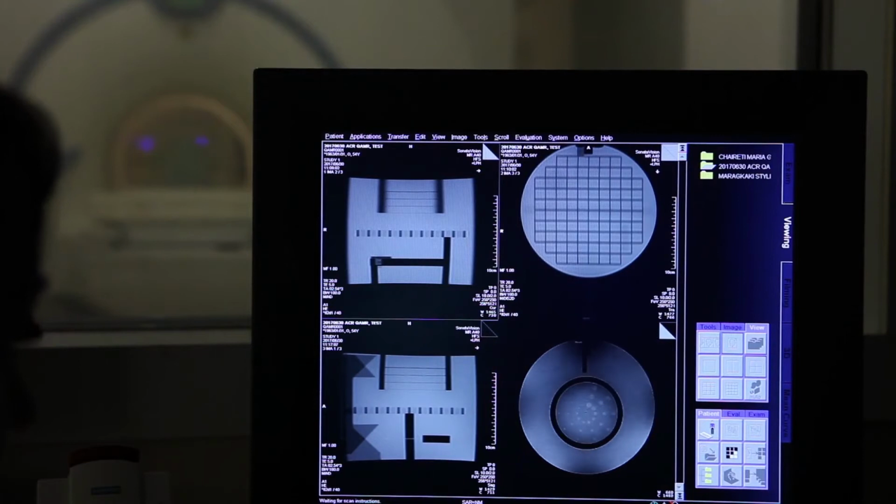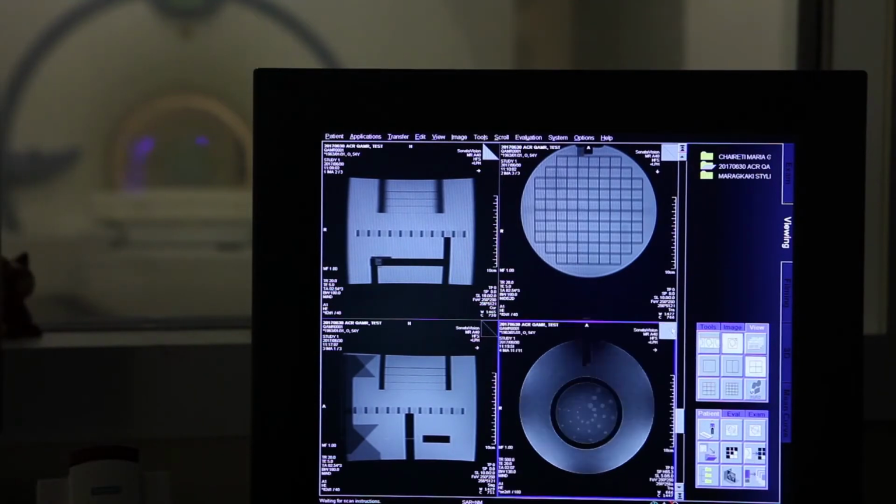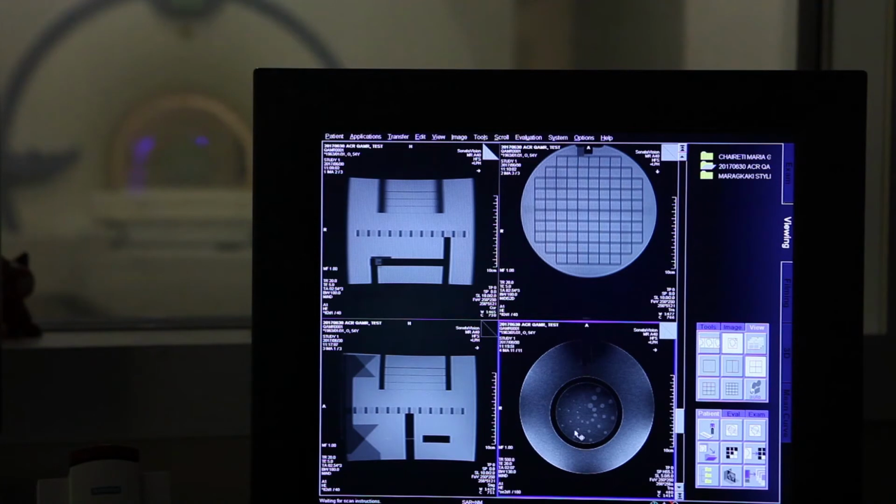In order to pass the machine, you measure the triplets. For this machine, you have to have about 36 triplets. Okay, I'm going to show how. 1, 2, 3, 4. You measure 36 triplets. You count the points, easily like that.